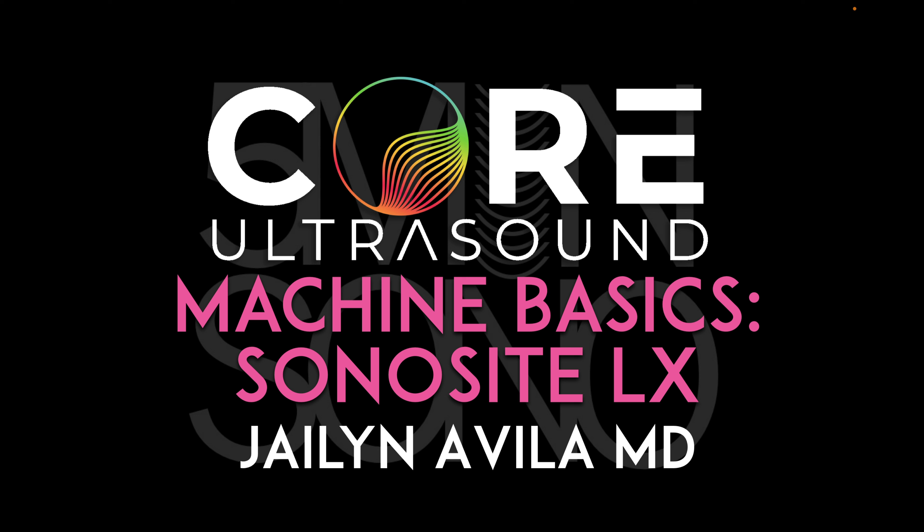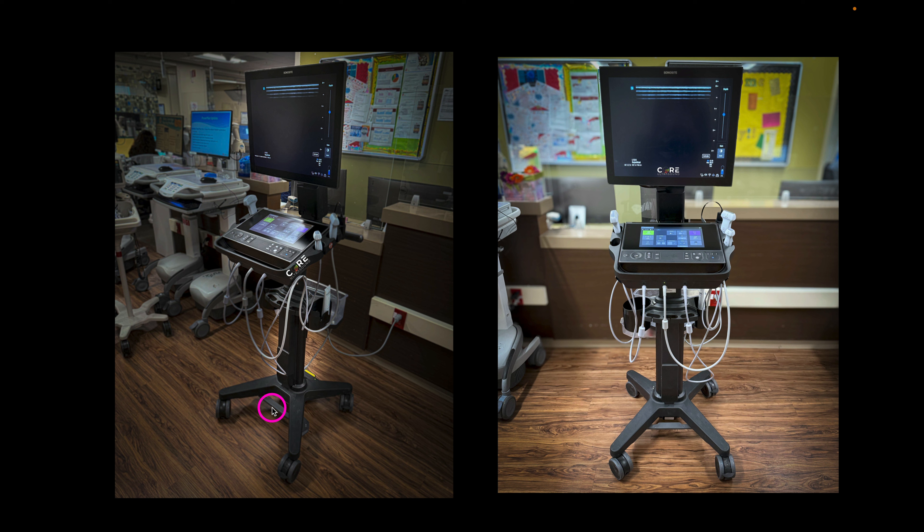Here is the machine. It has a quite large touchscreen down here. It is adjustable. You just press this down with your foot and you can actually move the entire base up and down. A little bit of caution: don't pull or transport the machine by grabbing this handle. You want to grab this handle in the back.